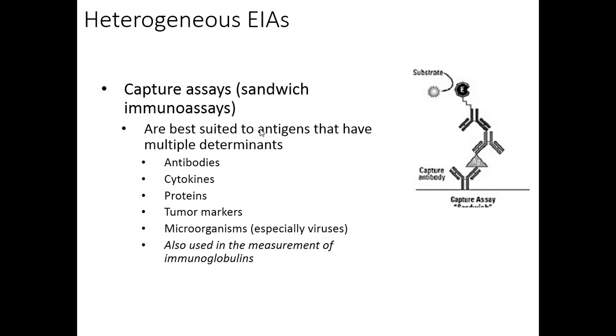Let's look at capture testing, capture assays, which, God help us, we're using capture again in the book. We had the antibody capture, from figure 11-2, which just told us how the antigens that were immobilized on the solid surface could capture an antibody. We also talked about what we call it when we immobilize an antibody to the solid surface. That's called what? The capture antibody, which are just the same terms in reverse. And now we have capture assays.